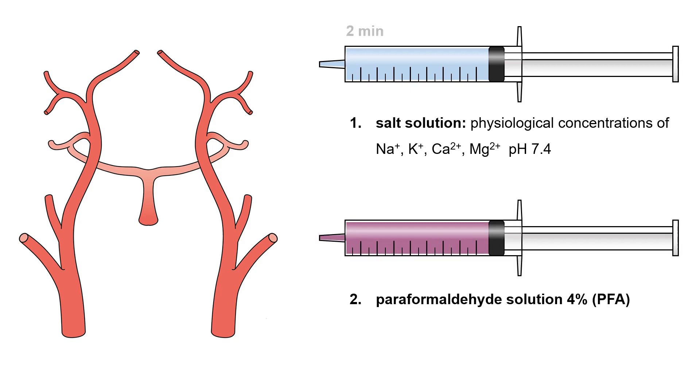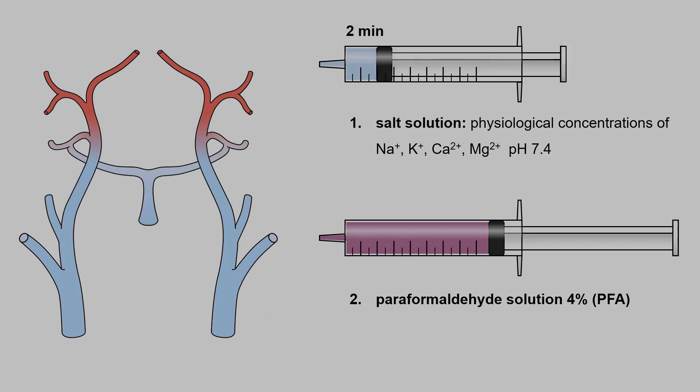Start the perfusion with solution number 1 for 2 minutes and continue with solution number 2 for 4 minutes.